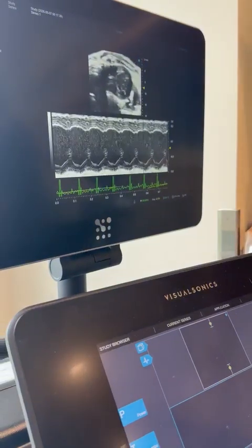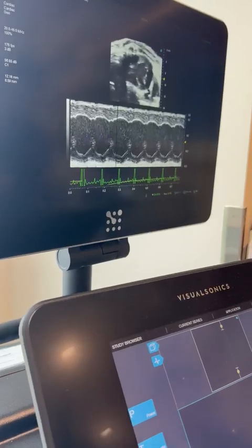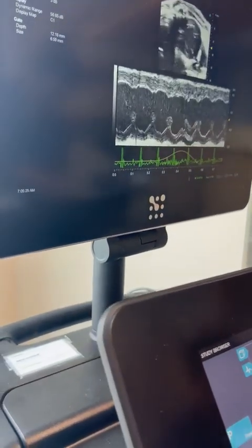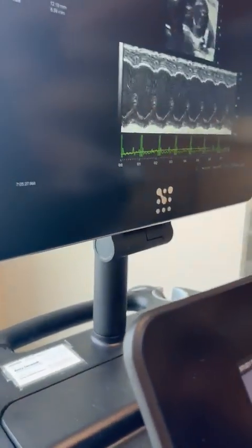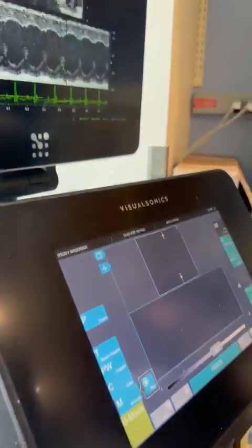One thing that's nice about this, it actually has leading impedance checks. And everything is just auto. It's nice to work with, and you can do analysis in LabChart.